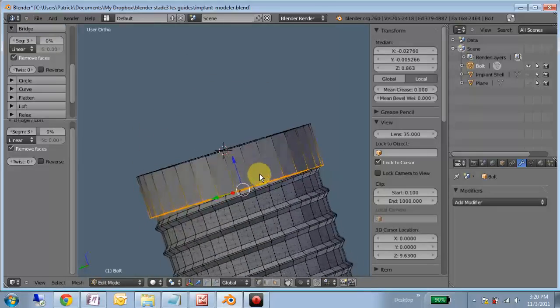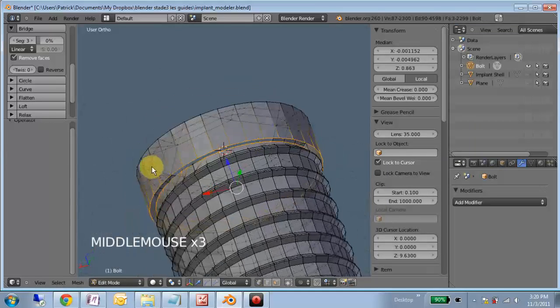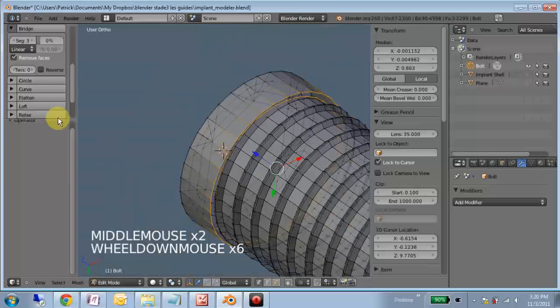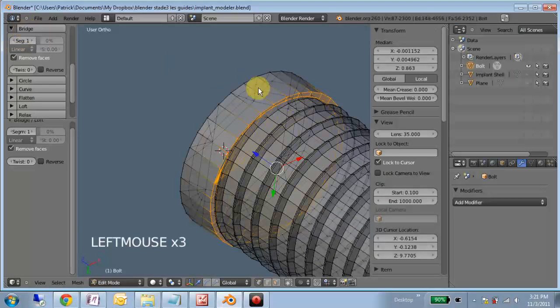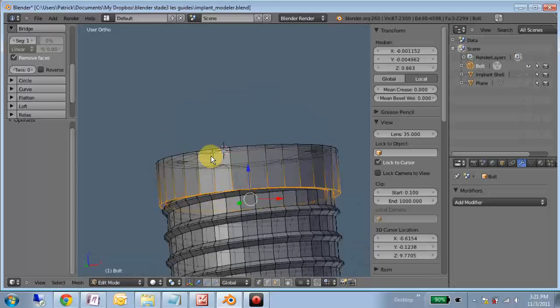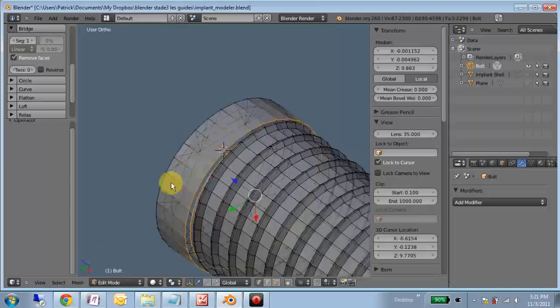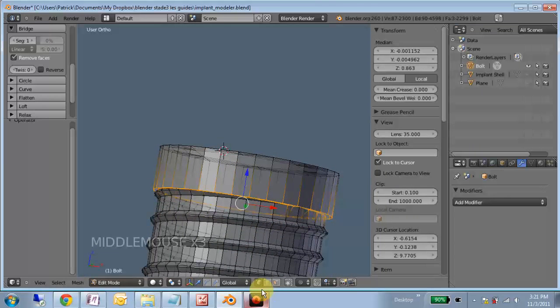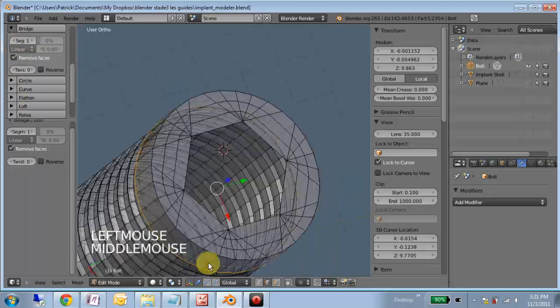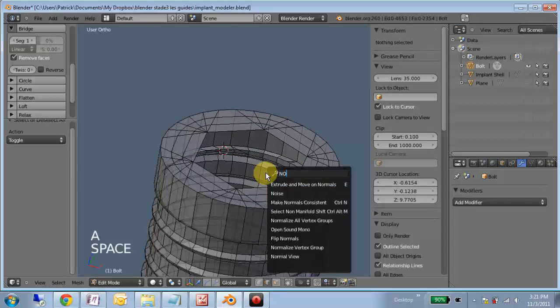Uh-oh. That is not good. Okay, well, we have a little problem there that we'll have to deal with later. Try this again. There we go. So make sure you're in edge select mode when you're selecting those non-manifold vertices.